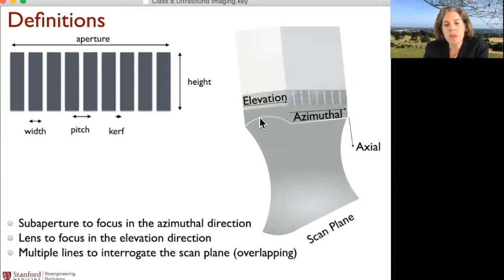Of course, just like in the in-plane direction, when you look at the slice direction, there's going to be a focusing effect, so that there's going to be a part where it's thinner, and that's going to be the focal zone in the slice direction as well.